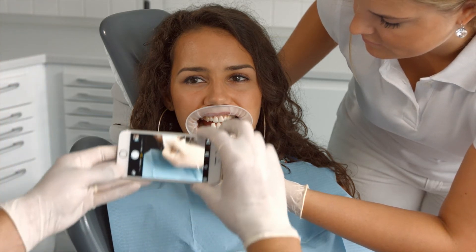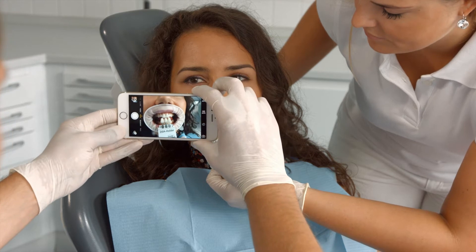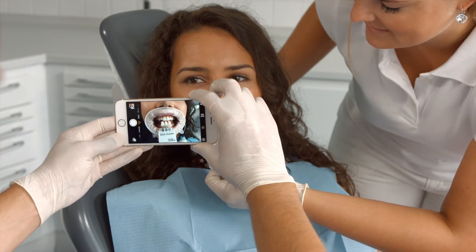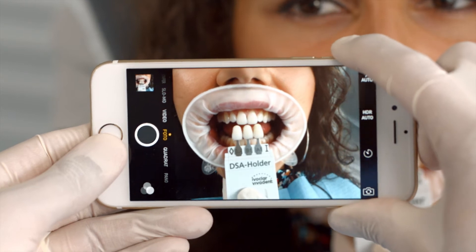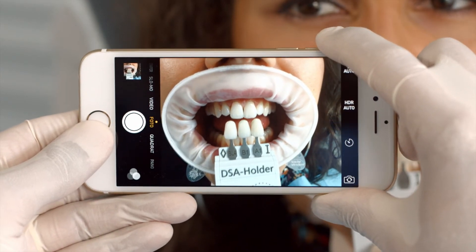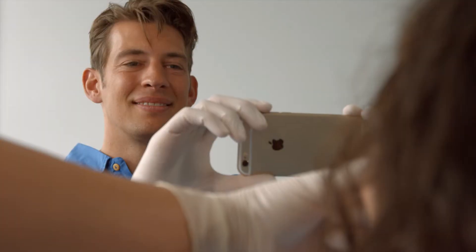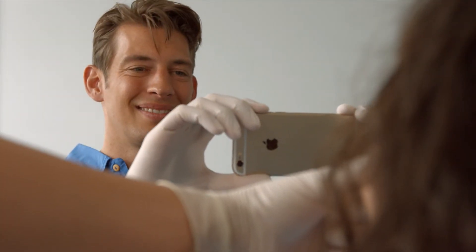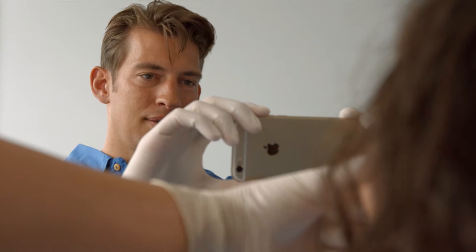Pay attention to the composition of the picture. The patient's mouth, the reference teeth, the labels on the shade tabs, and the markings in the upper two corners of the DSA holder should be at the center of the picture and shown as large as possible. Now snap your photographs. The quality of the photographs will determine the validity of the DSA analysis.